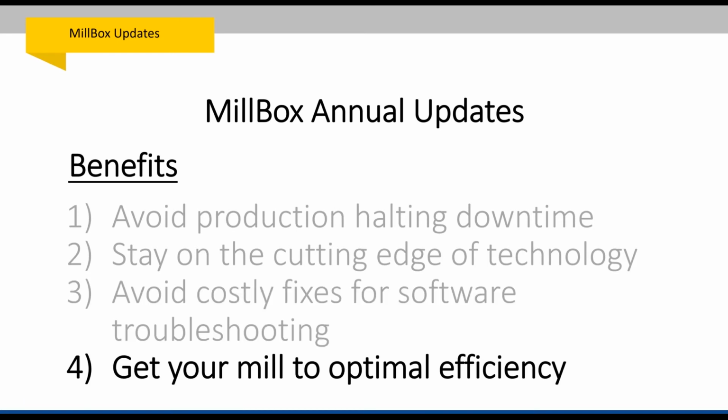Another benefit to you, and this is the fourth and final benefit before I show you some of these benefits, is that I want to get your mill to optimal efficiency. What am I talking about here? Well, all of these features that we implement, we're taking feedback from lab owners, from resellers, some, but mainly the end users, you. The person using the software is giving us feedback all around the world.